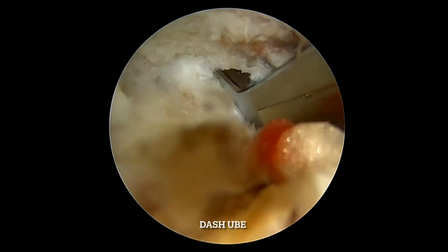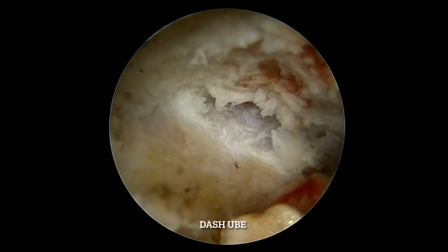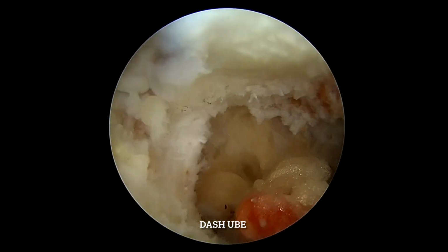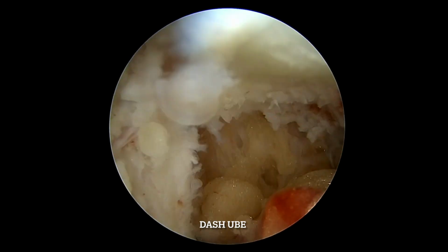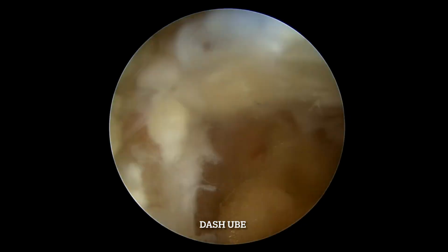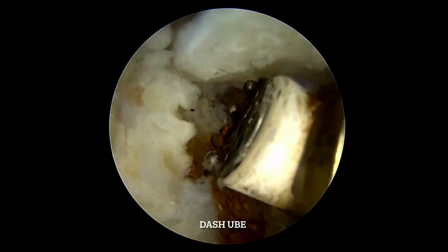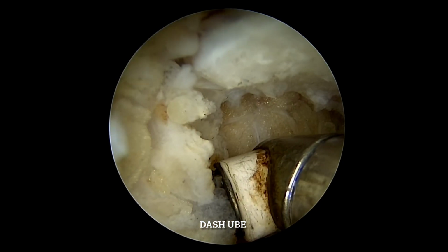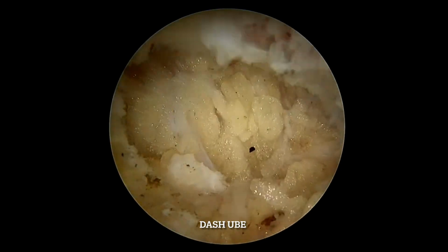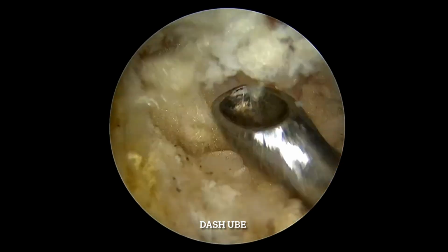I'm trying to tease out the foraminal ligament from here. You can see this area where the foraminal ligament has its attachment. Then you will use a curette to gently push the ligament out so that underneath you can see the perineural fat, which will point towards the identification of the exiting root. You can very well see the perineural fat here, the cushion which provides cushioning to the root.